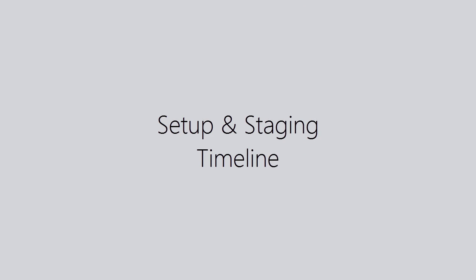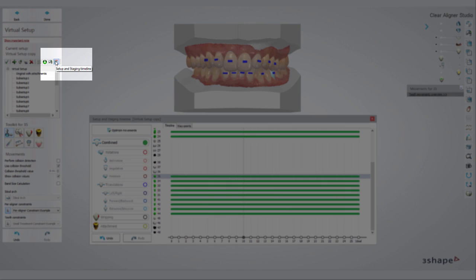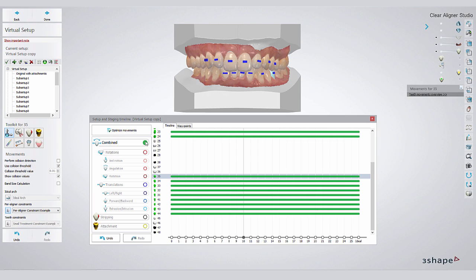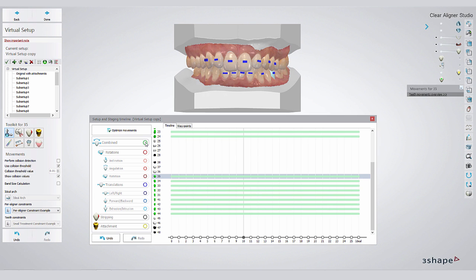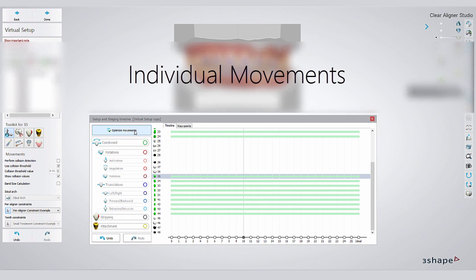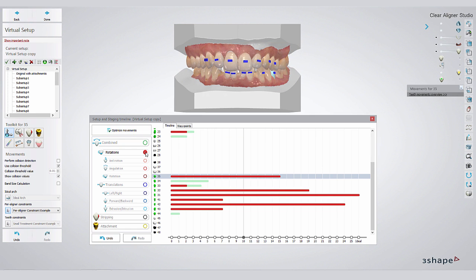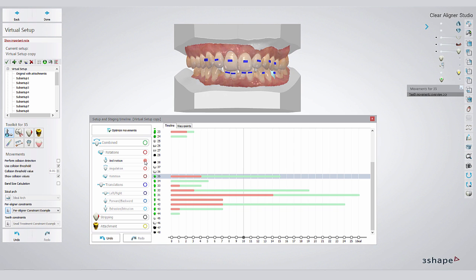The setup and staging timeline is an icon that opens a new window which displays the teeth movements and their distribution over the amount of aligners. This feature allows you a very detailed look at teeth movements. You select the tooth and the software will display all individual movements over the course of the treatment.